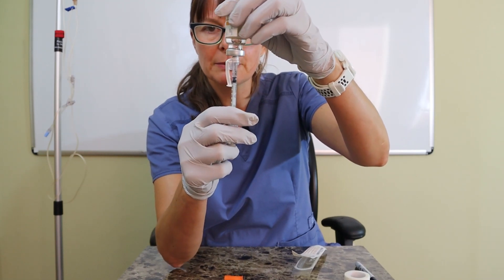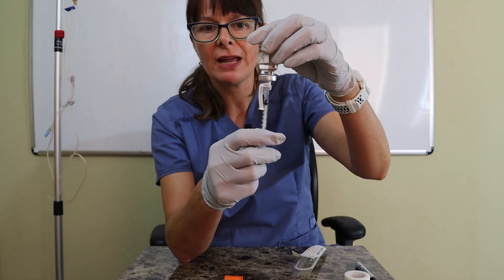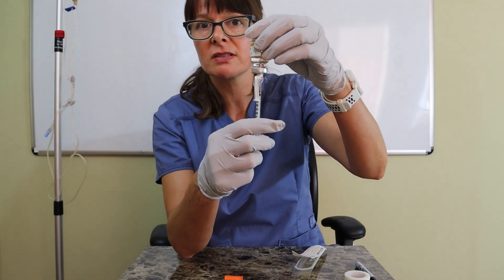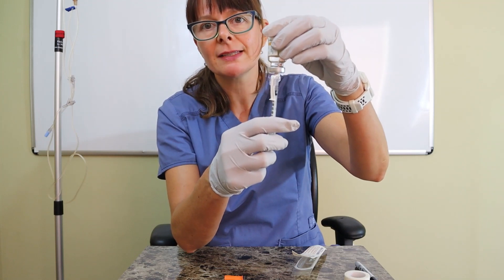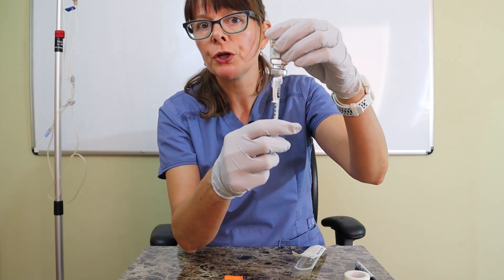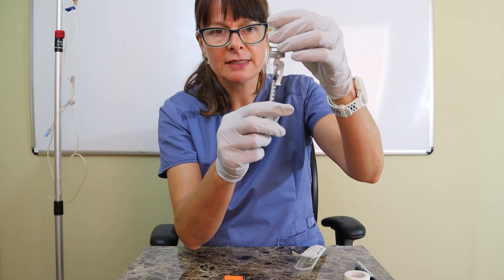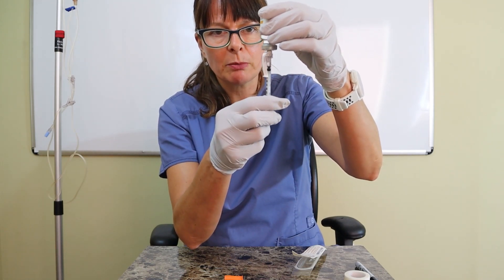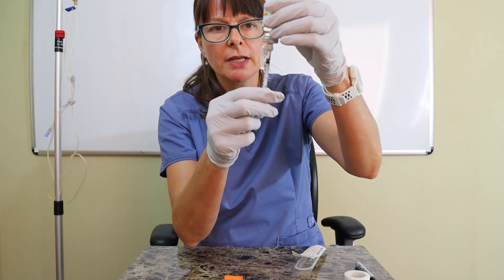Insulin can be tricky because we're dealing with such minor amounts — we cannot have any air bubbles, otherwise we risk giving the wrong dose. An air bubble could easily take up the space of one unit of insulin. In this case I was lucky and didn't get any air bubbles, so I'm going to push the plunger back to the 10-unit mark.